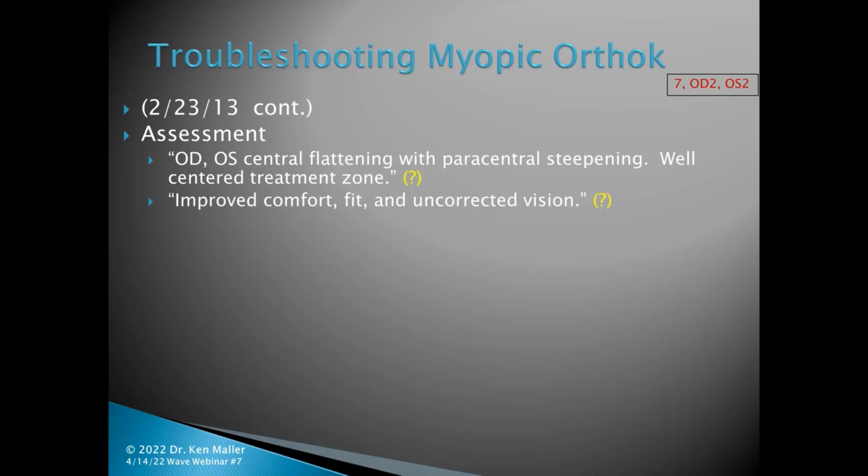Well, again, that yellow question mark is mine because they didn't comment to me about the comfort, but from the fit and the uncorrected vision, that didn't look like it was really improved to me. Continue with the current lenses and recheck 1 week.